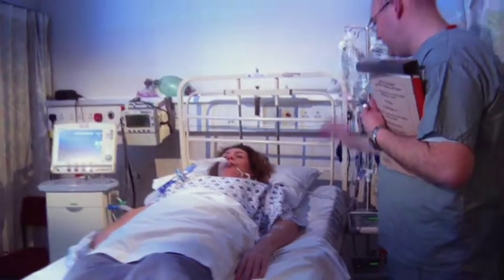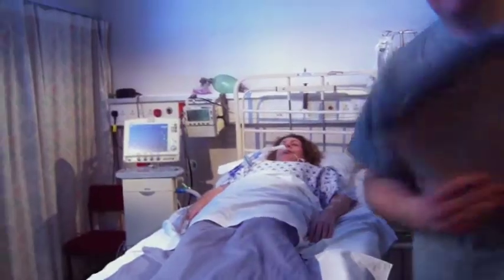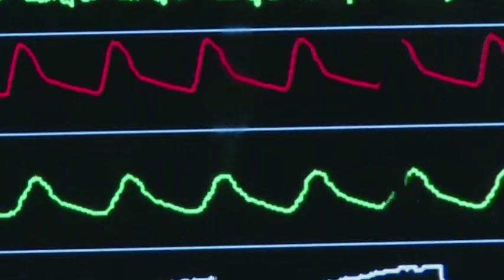Before transfer takes place, checks need to occur using the ABC approach. If appropriate, the receiving centre should be contacted for specialist advice. Airway assessment should include clinical and radiological assessment of endotracheal tube position. Adequacy of ventilation should be assessed using end-tidal CO2, pulse oximetry and arterial blood gas analysis. Ensure an adequate circulation for the journey, so secure all intravenous access. Bleeding and shock should be managed using fluids and inotropes, etc.